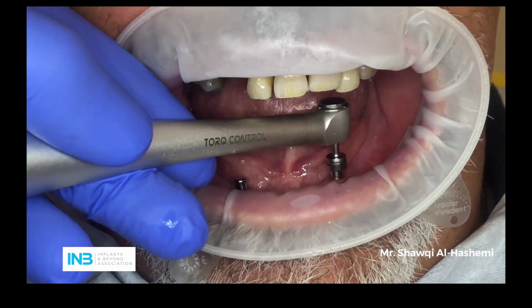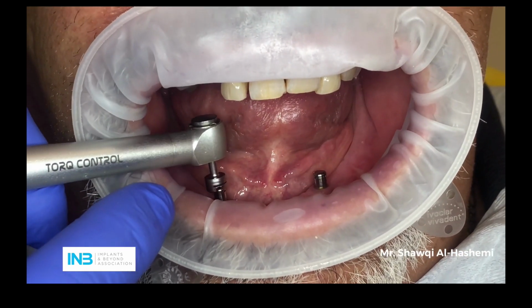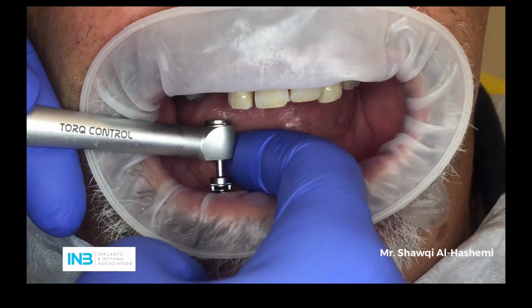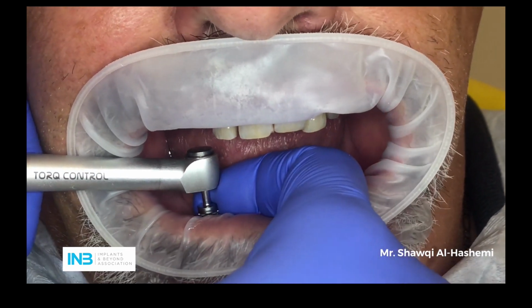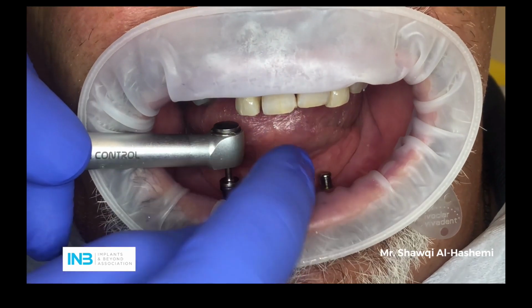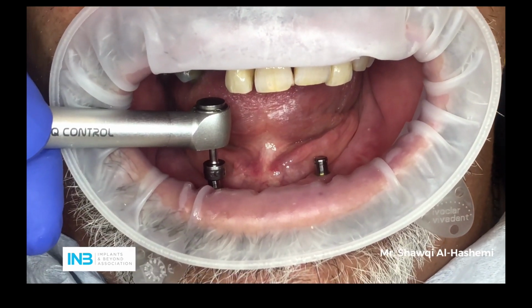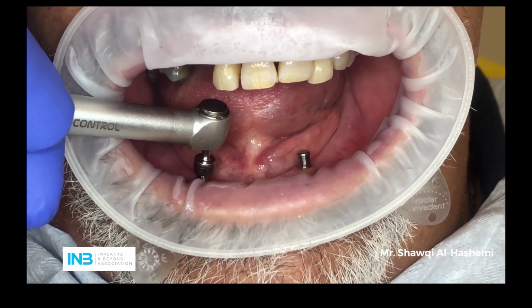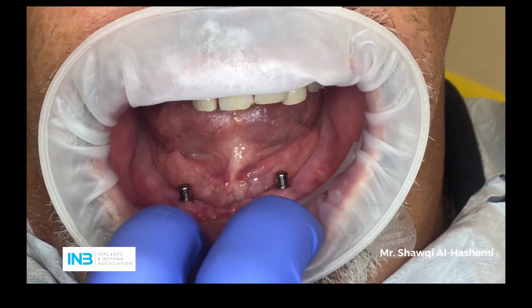Okay, and we do exactly the same on the opposite side. We just take this one out just like this, and you do the same thing here. Right, again, you just engage this slightly. Just find a slot. So it could be fiddly in the beginning. There you go, that's a slot there. So now again, I'm just going to torque it. So that is 20, 25, and that's 30. Okay, so that's 30 Newton, and both are fully seated.